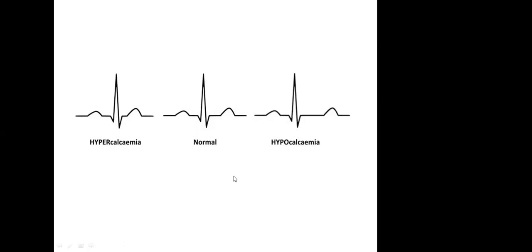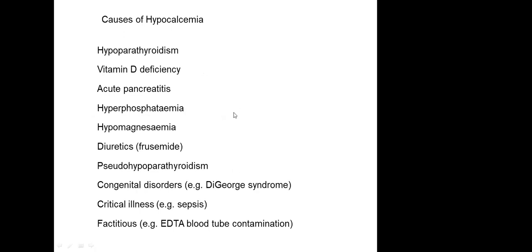What is corrected QT? Corrected QT is when we correct it in context with the RR interval. We take it to generalize and apply the relevance of calculating QT by ensuring that we calculate it in comparison with every RR interval.